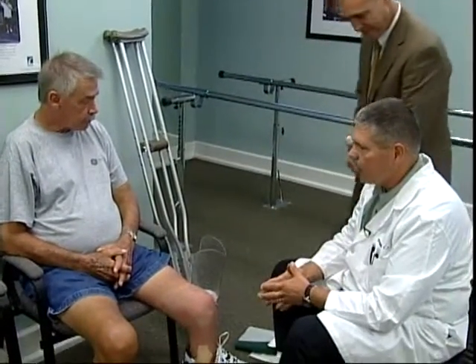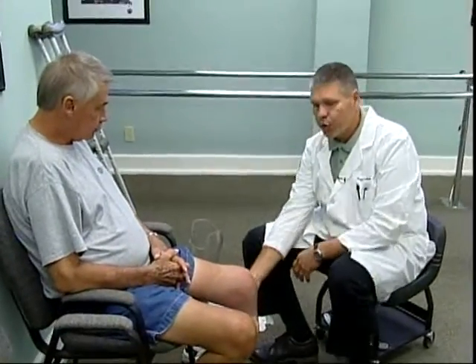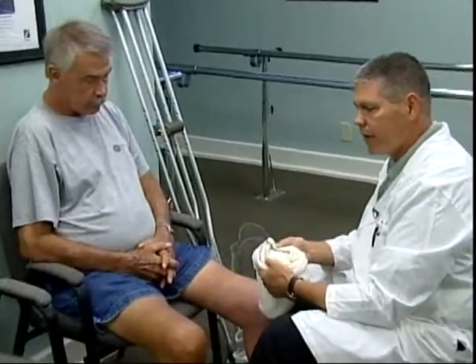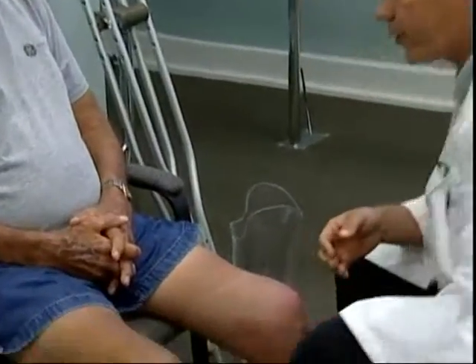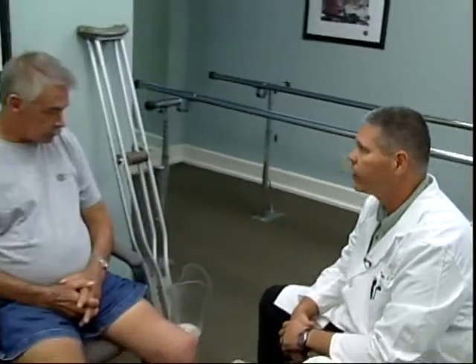What we're doing here today is a diagnostic test socket fitting. Anthony started out with a preparatory device with a manual locking system, which was used to hold the prosthesis in place. His limb has atrophied and matured to the point where he's wearing multiple socks to try to keep the device in place. So what we're doing today is a socket replacement, and we're going to introduce vacuum technology to hold the device in place. We're hoping to improve his comfort and his stability, and at the same time progress him even further from crutches to single cane ambulation or even unassisted ambulation. That's our goals with this device today.